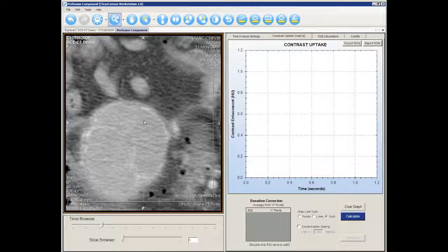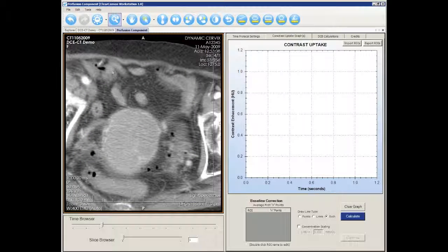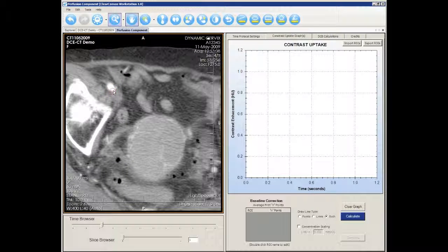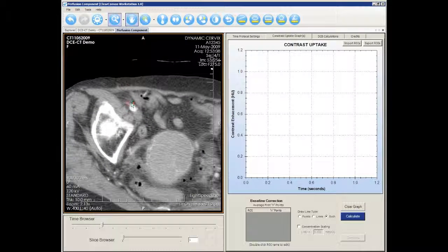Or you can press the Ctrl key and use the scroll wheel to zoom. Use the hand to pan the image across the screen, or you can press the Ctrl key and left click to pan.